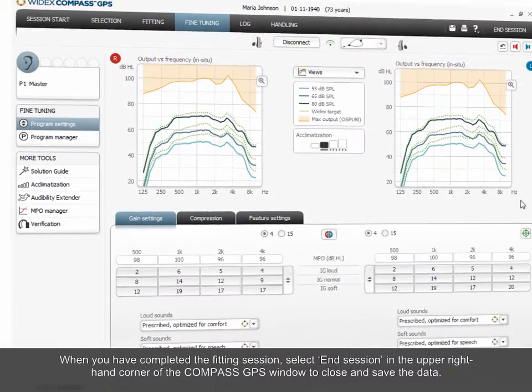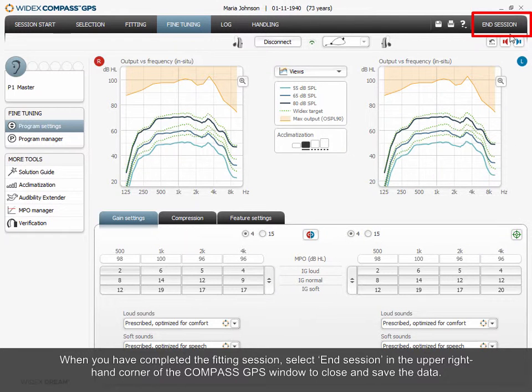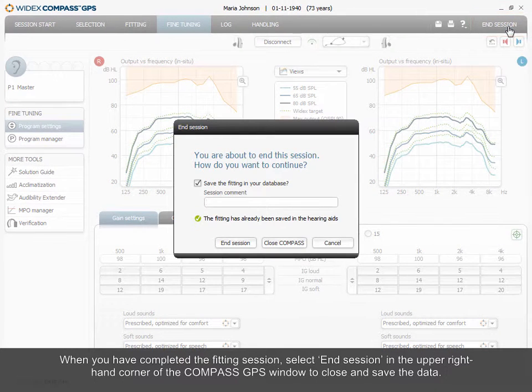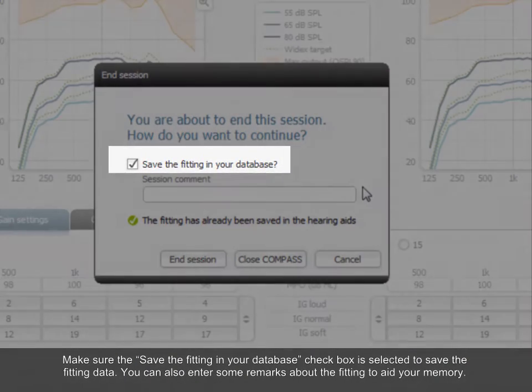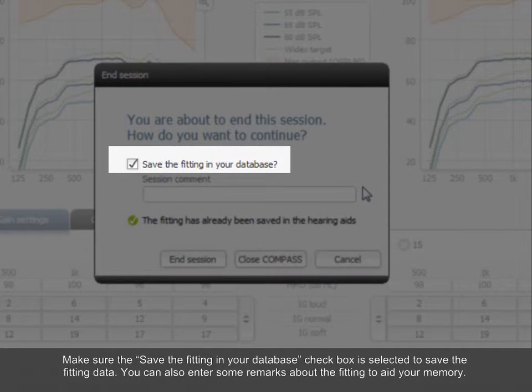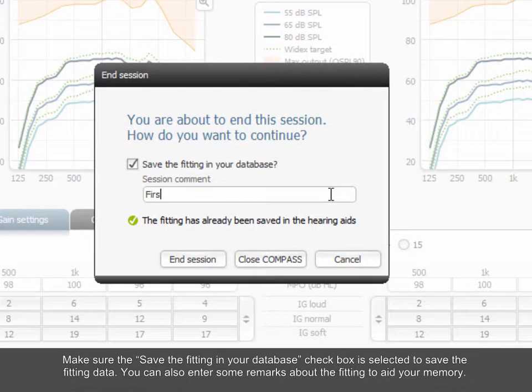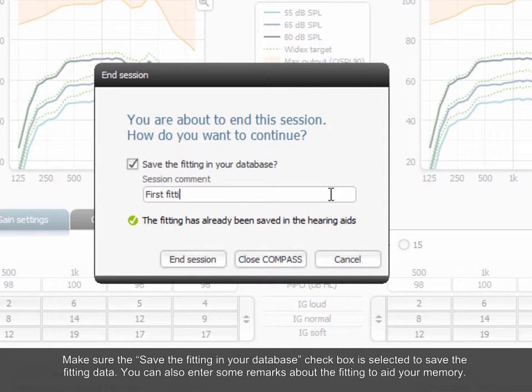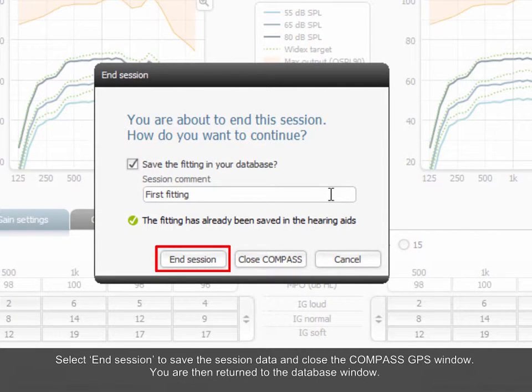When you have completed the fitting session, select End Session in the upper right-hand corner of the Compass GPS window to close and save the data. Make sure the Save the Fitting in your database checkbox is selected to save the fitting data. You can also enter some remarks about the fitting to aid your memory. Select End Session to save the session data and close the Compass GPS window.